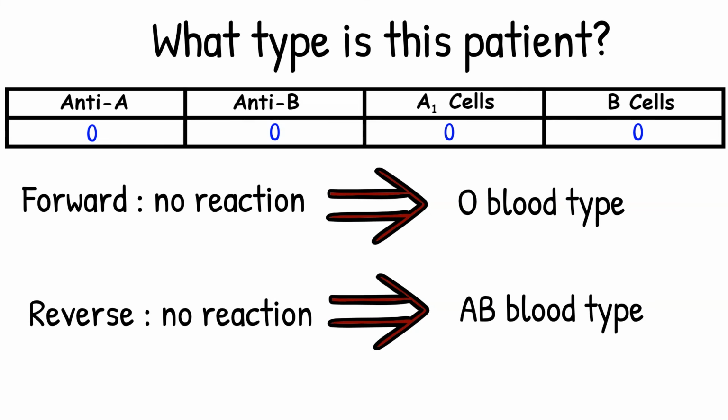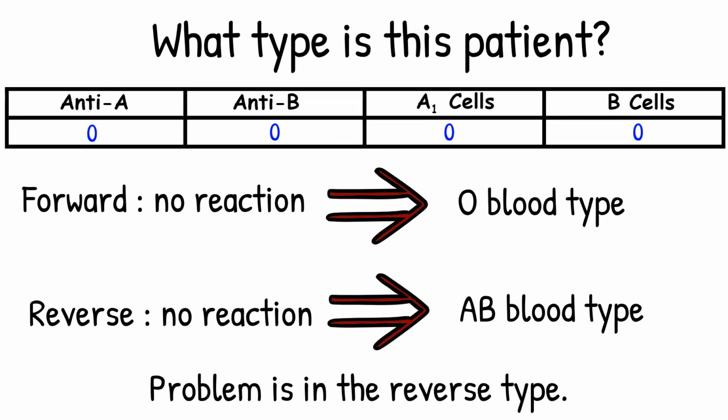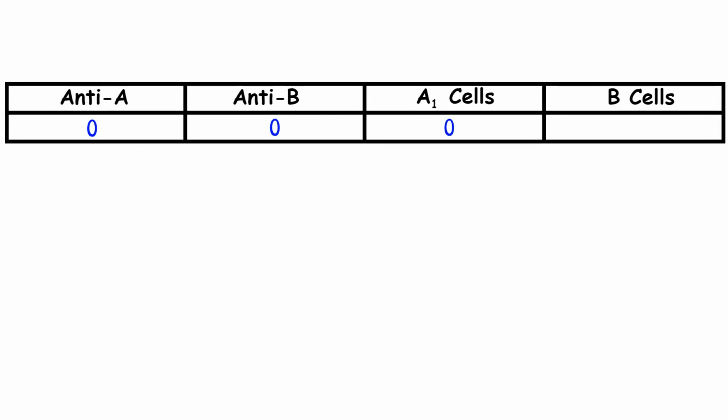The red blood cells antigen is usually reacting really strongly. So my first thought is missing reactions in the reverse typing. This means that the patient is potentially type O, but missing anti-A and anti-B in the patient's serum or plasma. I will assume that I did everything correctly and I get the same reactivity when I repeat.